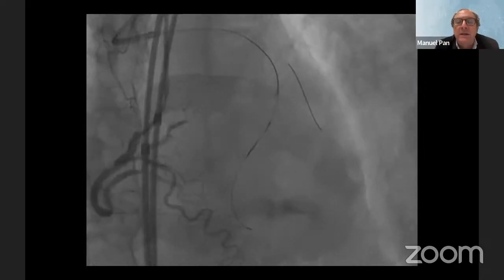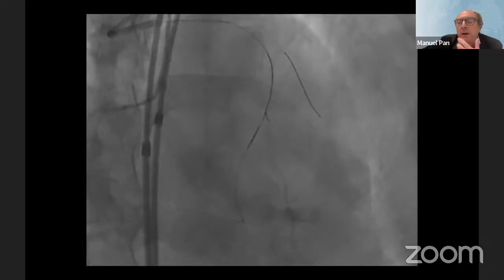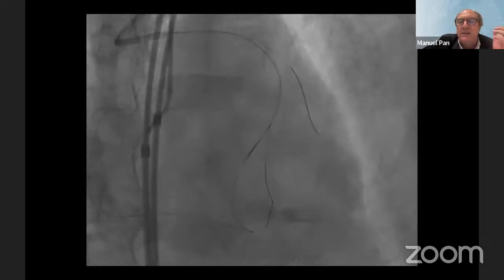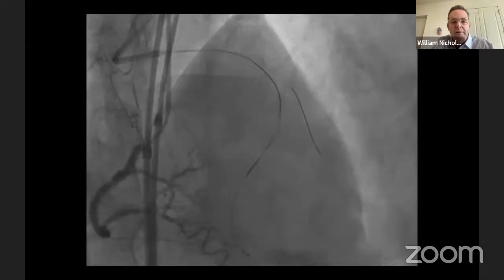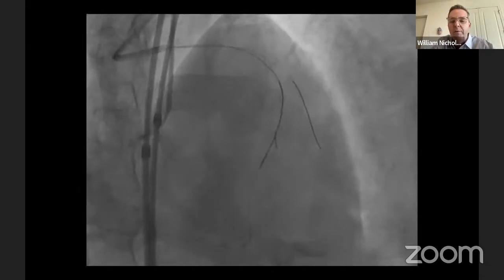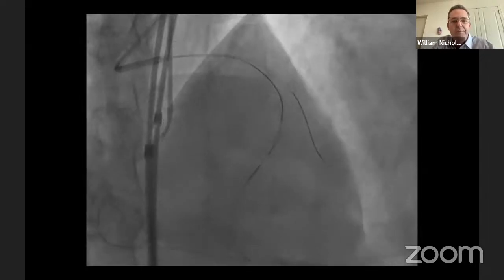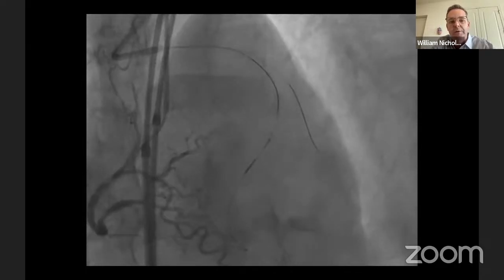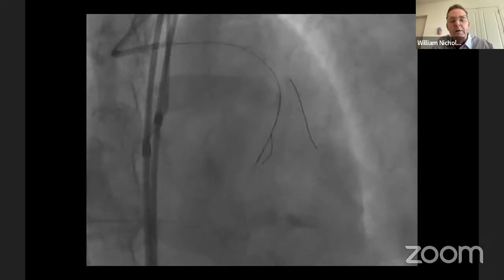Did you consider the use of a double lumen catheter through the diagonal wire and use the retrograde wire as a kissing wire technique? I think we do that a lot. So we use a ton of dual lumen catheters for that very purpose. And I think it would have been a very reasonable alternative strategy, probably may have been successful as well. I think if this hadn't worked, what we were doing, if we couldn't wire into that, I think that would have been probably the next step to do.